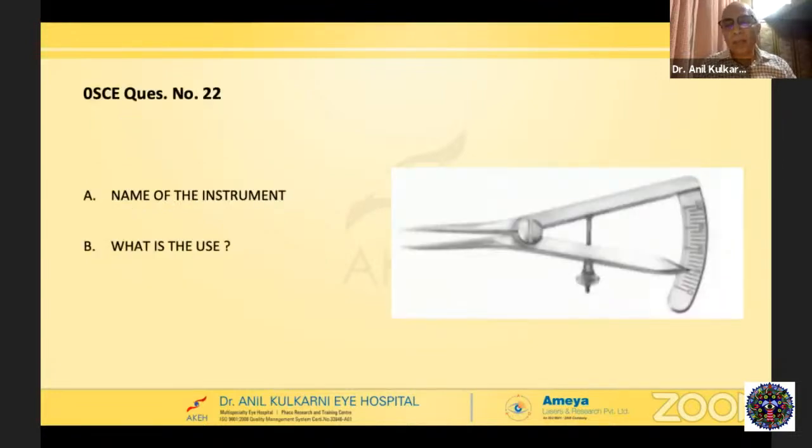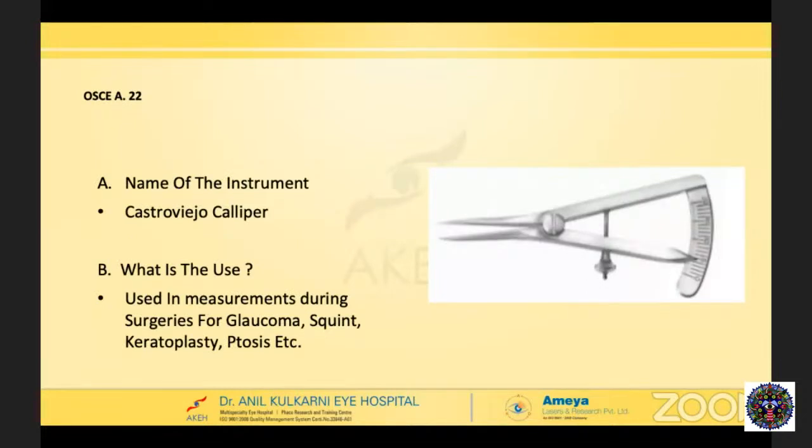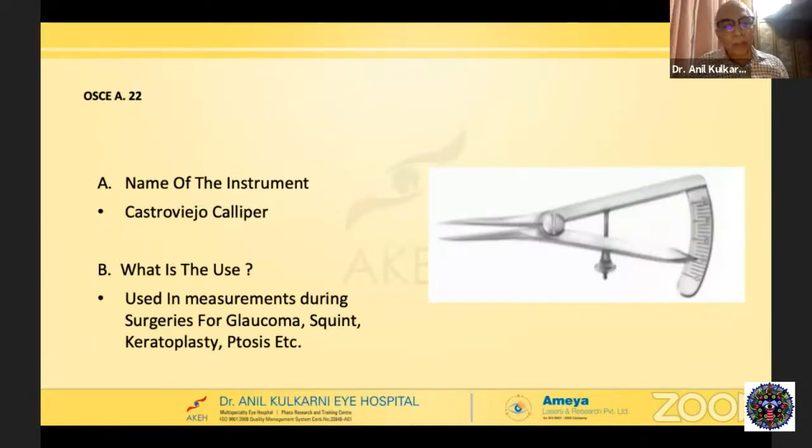22. This should be very simple. The name of the instrument is Castroviejo ophthalmic caliper.